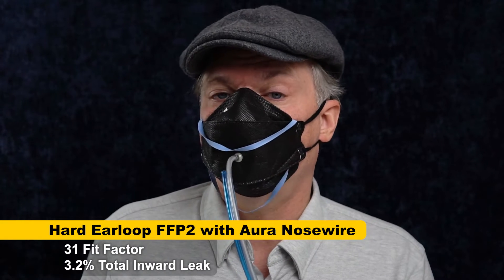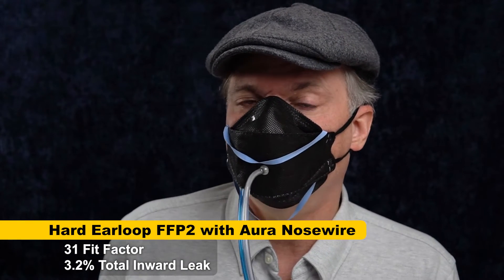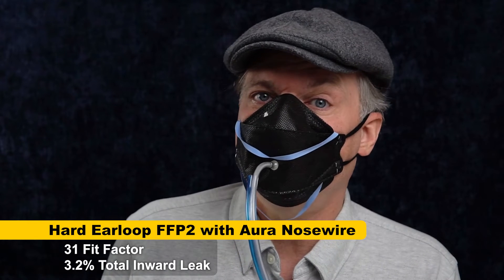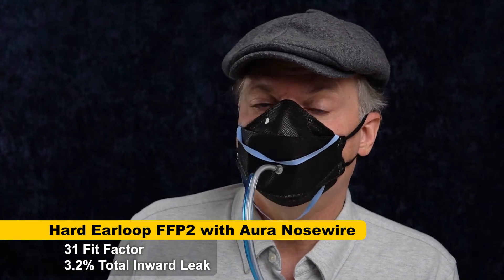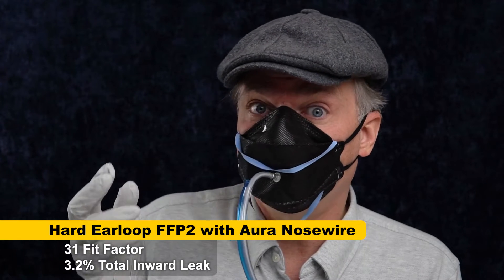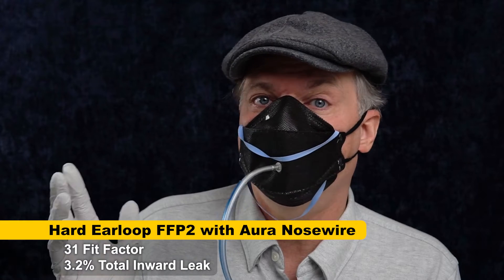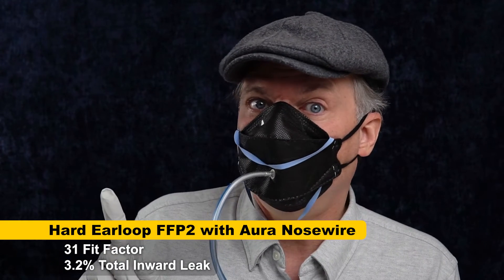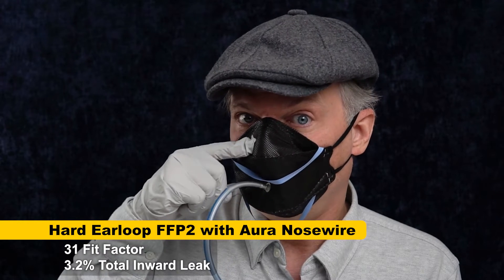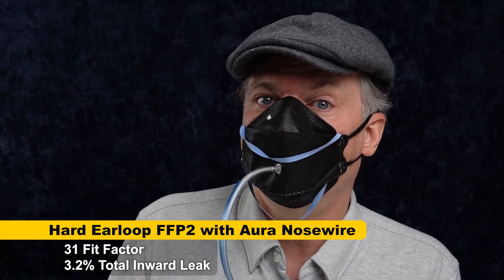The result is 31. I think 31 is enough of a difference to say that's significant — it's a much bigger jump than going from 10 to 12. So an improved nose wire could make the Hard mask a better mask, for me at least. Not sure if it would help you because you might not have the same issues I've got.